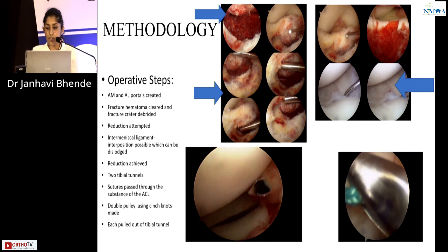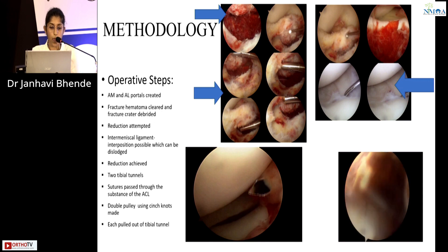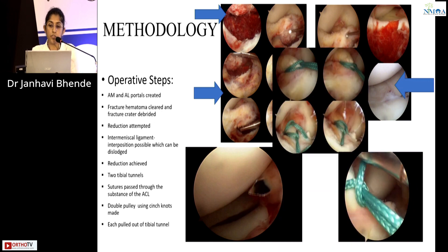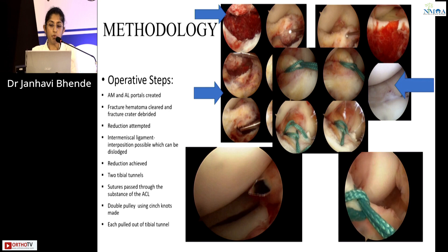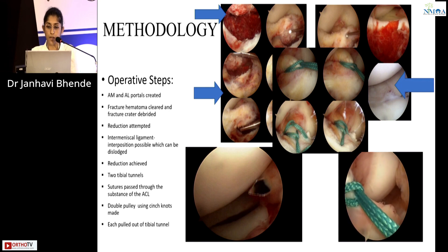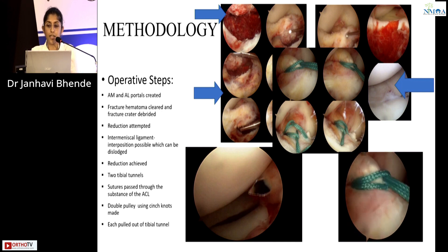Cinch knots are created as can be seen in the video, and two such cinch knots are created. The sutures are then pulled out of the tibial tunnel to create the double pulley. The double pulley then pulls down on the fracture fragment, creating even compression on the fracture. The sutures are then tied over the anterior cortex of the tibia.